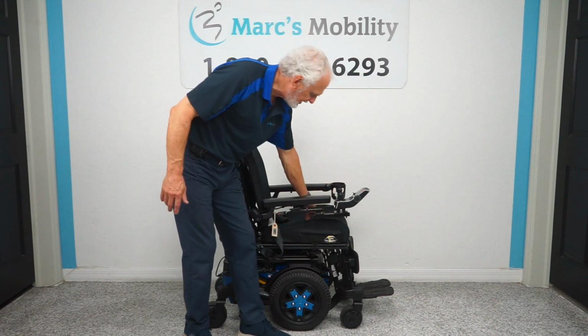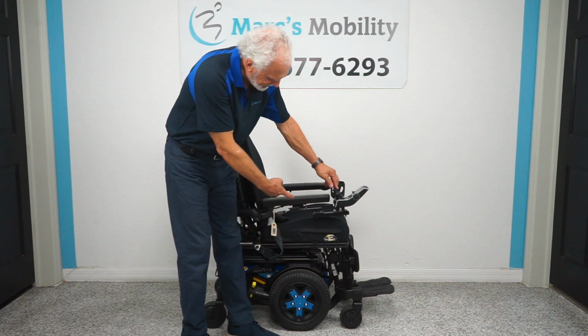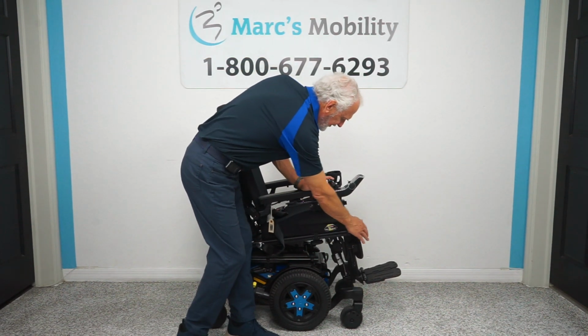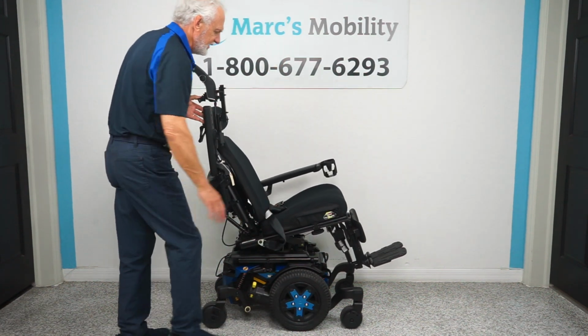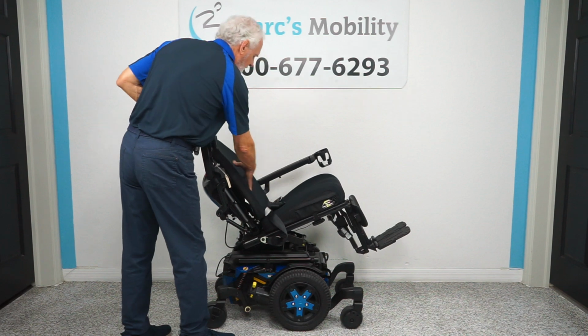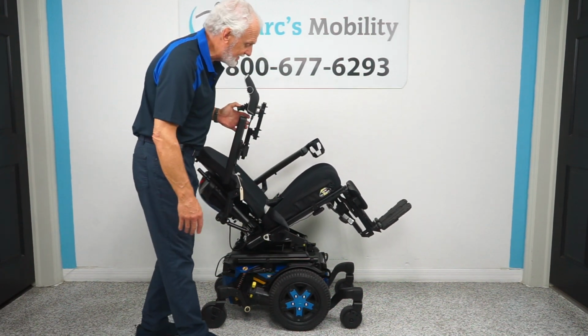So right now it's already yellow here and yellow here. So I'm just going to go like this, push it back, and you'll see the seat start to tilt. Tilting is when the bottom goes back. Of course, it's going to take the leg and the back because they're all connected to the tilt. This has a lot of medical benefits if you want to reduce pressure off your bottom, pressure off your back. You want to relax. You want to have circulation in your legs.